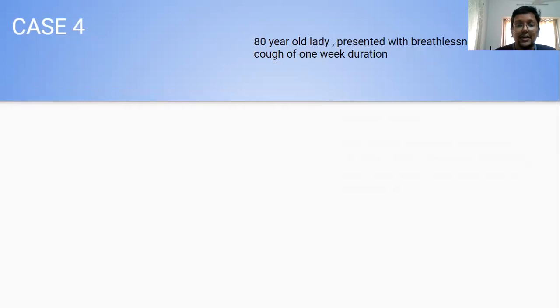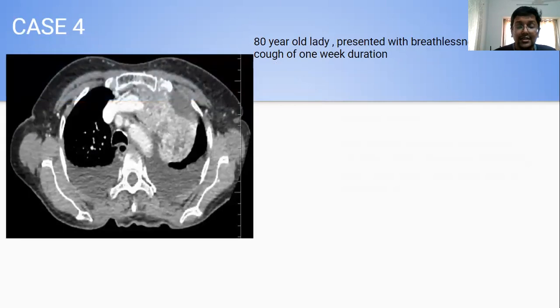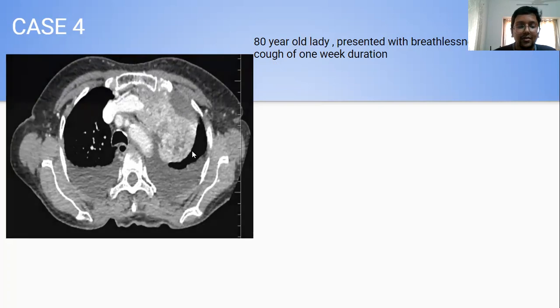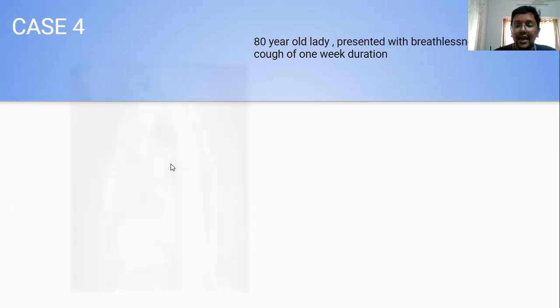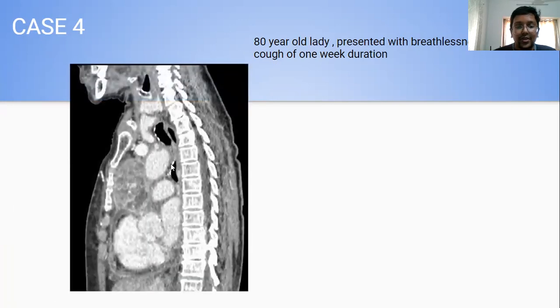Case 4 was an 80-year-old lady who presented with breathlessness and cough for one week. CT revealed an irregularly marginated, heterogeneously enhancing solid-cystic lesion with predominant solid component, showing heterogeneous post-contrast enhancement with erosion of adjacent bones — especially the rib and left half of the manubrium sterni — and vascular infiltration. Bilateral pleural effusion was also noted. Coronal and sagittal images revealed chunky calcifications within the lesion. This turned out to be a type B3 thymoma.